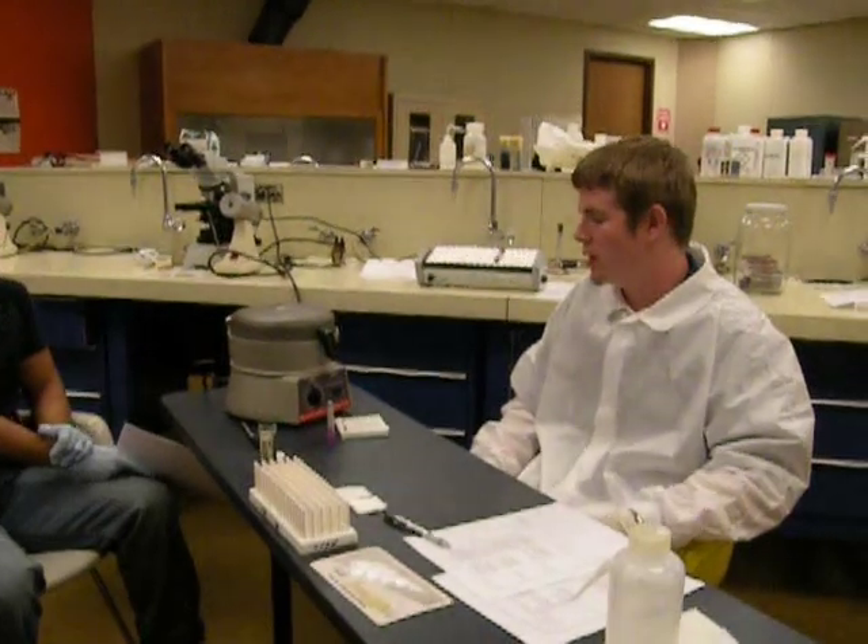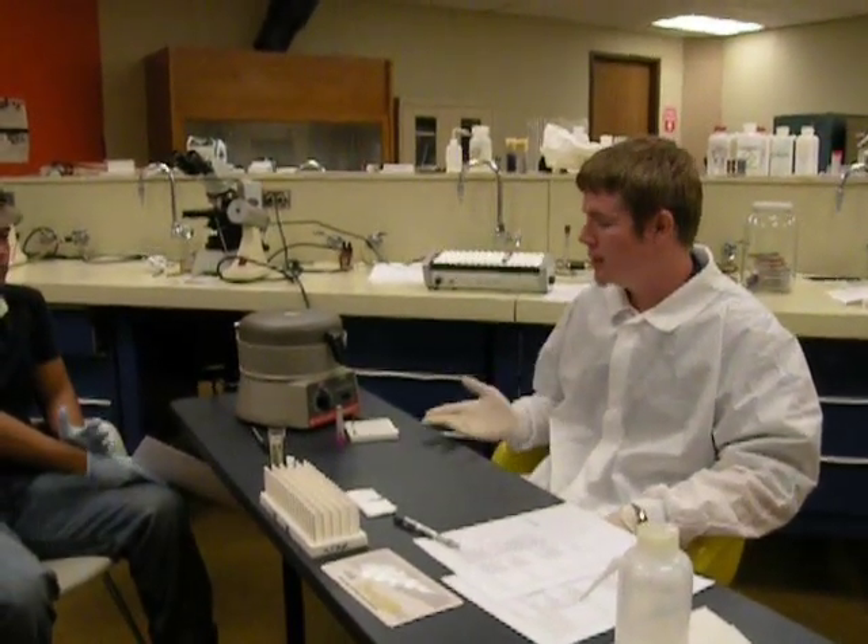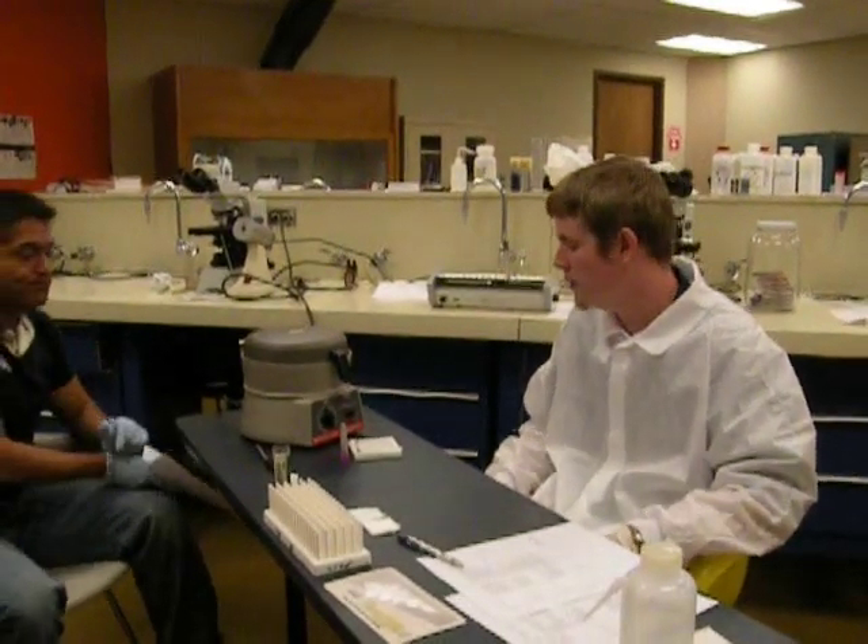Hi, my name is Brent Mason, and today I'm going to discuss with you how to perform a Spun Hematocrit. Today I will be showing the equipment needed to perform a Spun Hematocrit, the techniques used, and how to read the results once the Spun Hematocrit is complete.